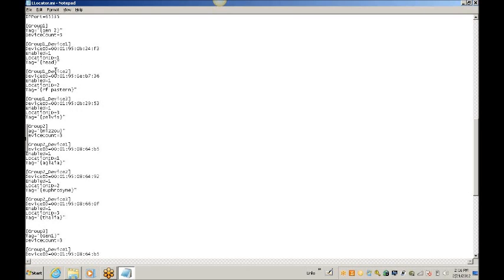Older systems may have some different naming of these. Newer systems should be labeled head, right front or right front pastern, and pelvis to make it easier to identify. But device 1 is always the head, device 2 is always the right front, and device 3 is always the pelvis. So you want to be sure that you're changing the correct sensor. You will be supplied with the Bluetooth information, and what you need to change is typically the last 4 or the last 6 characters.